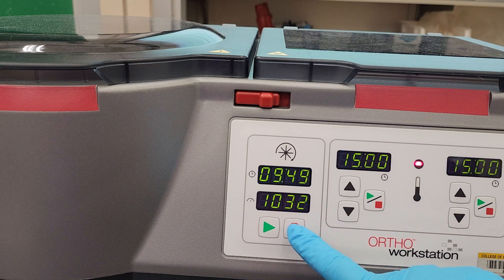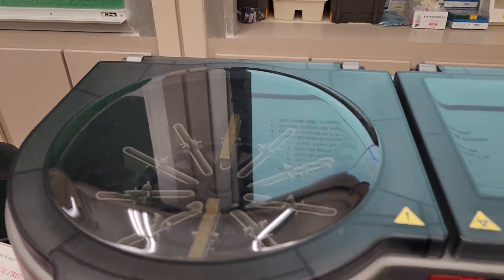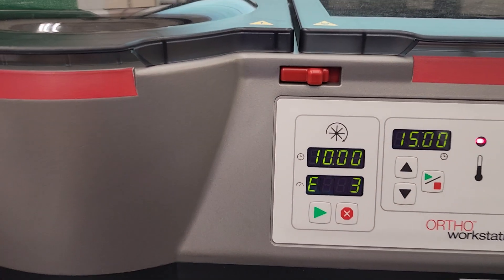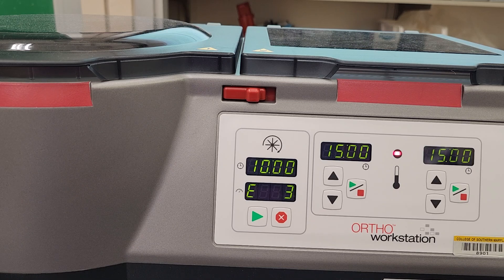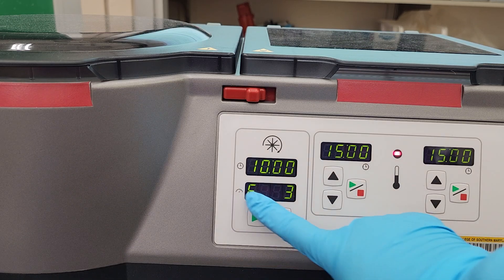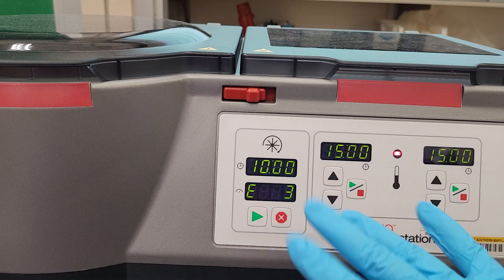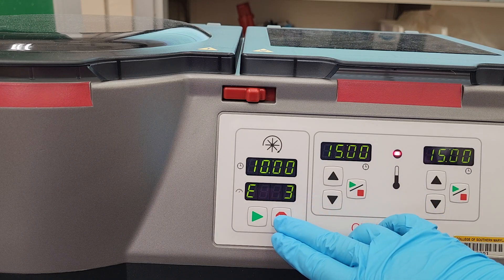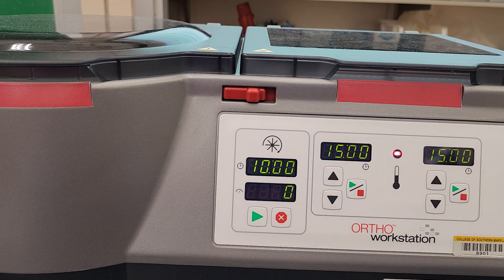We don't ever really want to press stop because it jerks — it completely stops. With a centrifuge, you always want to brake it slowly, and it gives you an error right here. But I'm just doing that for the video so you could see what it looked like. Now I press stop again and it goes back to the normal RPMs.